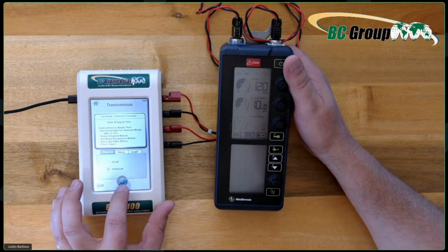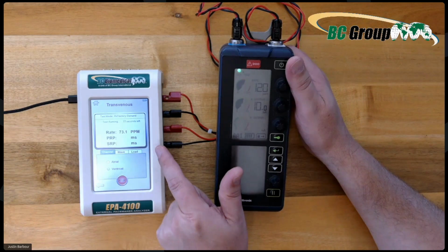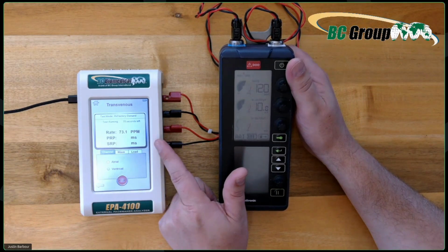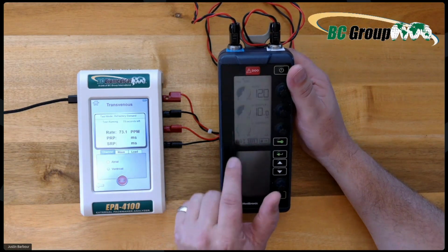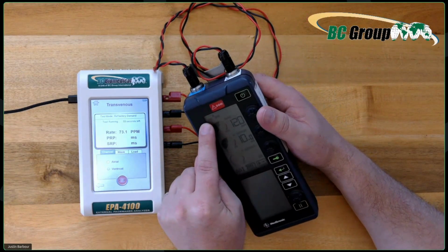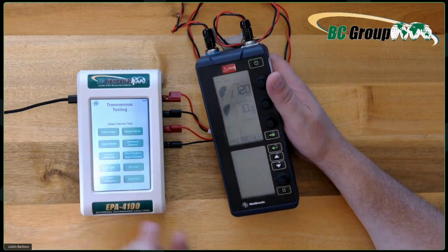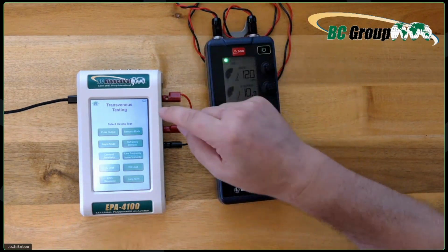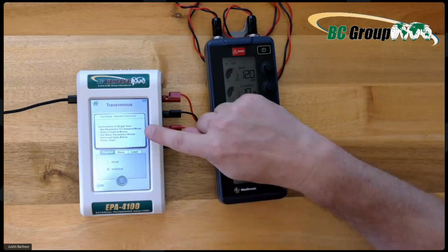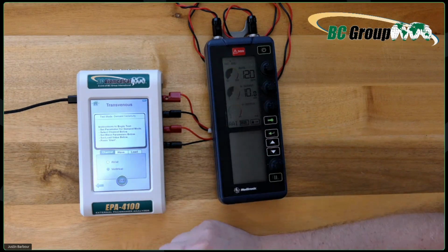And like I said earlier, we can change from atrial to ventricle. And it's not going to show anything because remember, we're on AAI, which means that the atria is being paced. So we do have instructions built into the device. It tells you what to do, and then it tells you how to start the test.